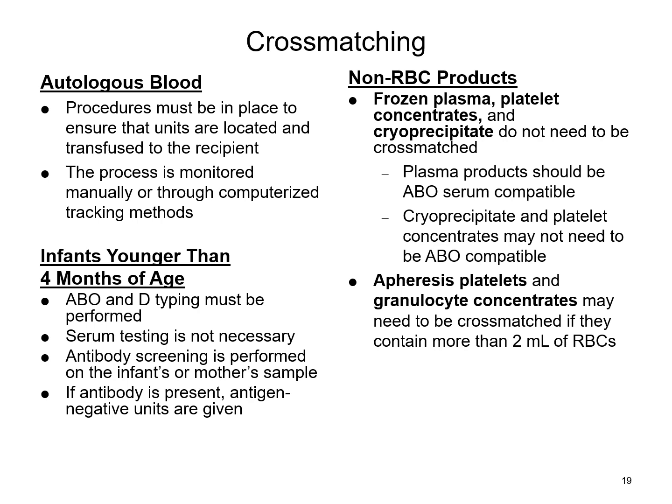And you have to have a particular spot designated for those autologous units, because you cannot mix those in with your regular units and accidentally give that autologous donation to another patient in your facility. So you have to have something in place to separate that and monitor it throughout that entire process. Your facility will also have a policy as to whether or not you'll do a full cross match on that patient as well, depending on the scenario and situation.